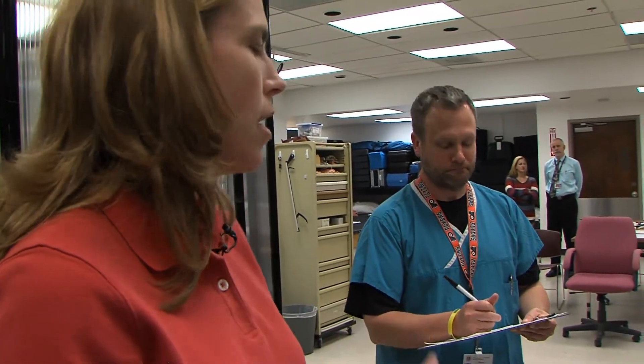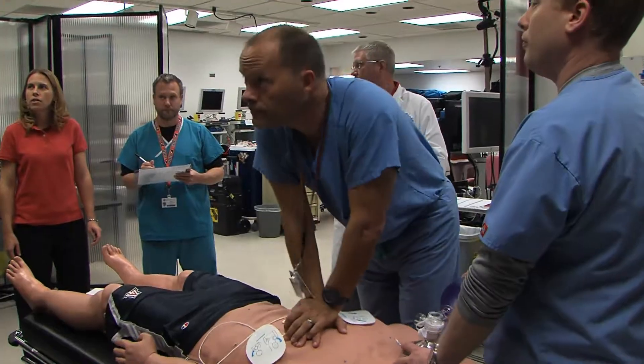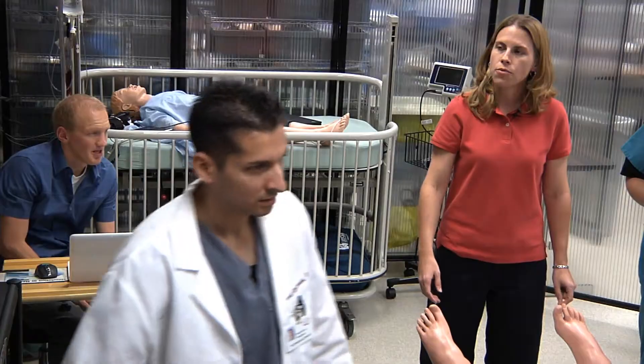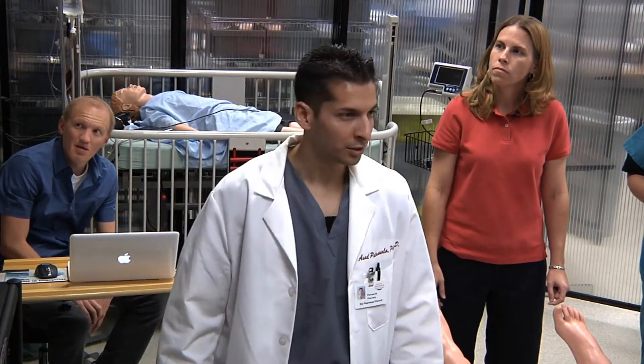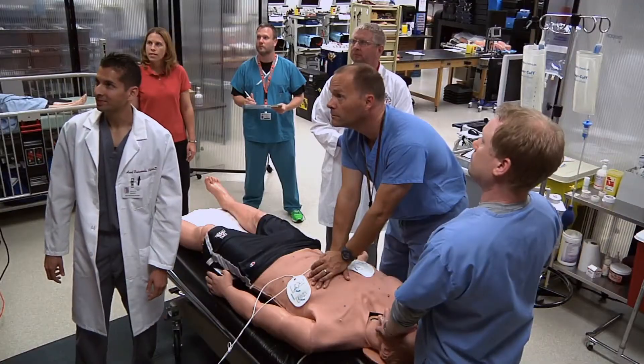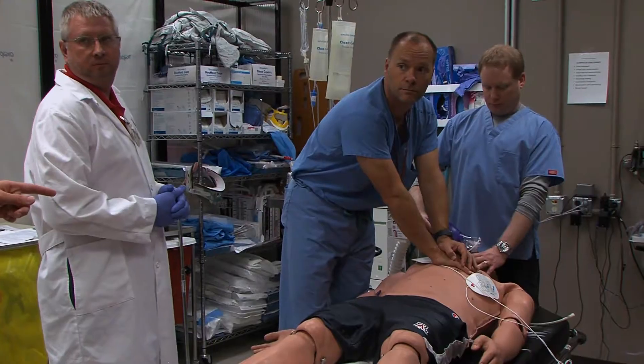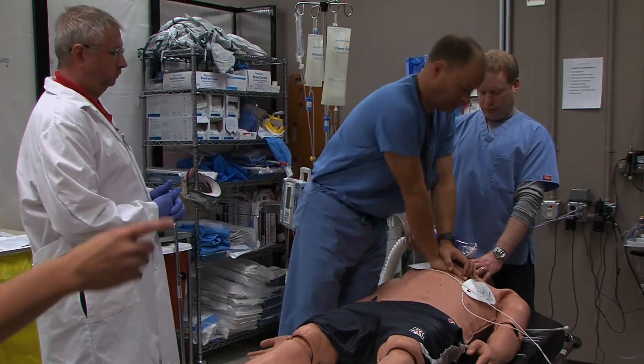Is someone timing and recording this code? I'm recording the code. Let's go ahead and stop compressions and assess the rhythm. The patient is in V-fib? Yes, the patient is still in V-fib. Let's resume chest compressions.